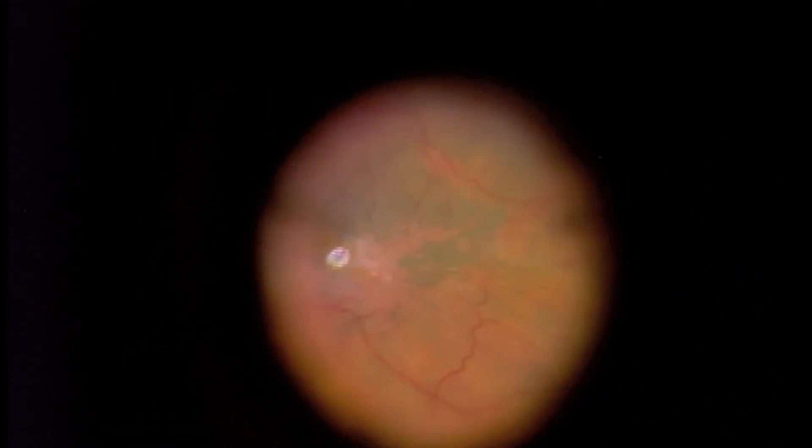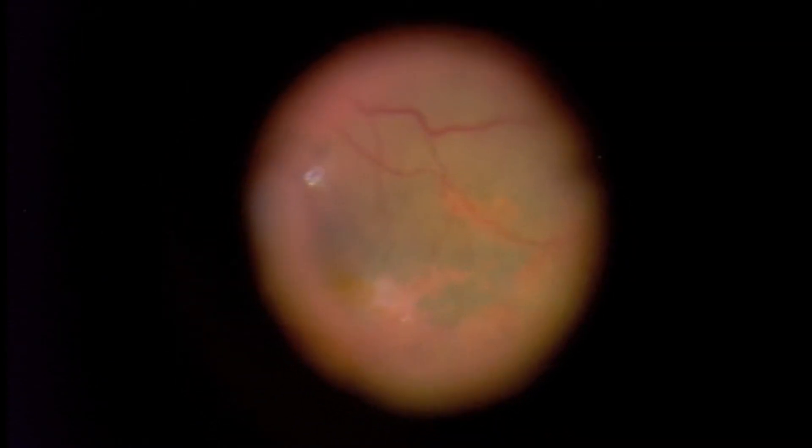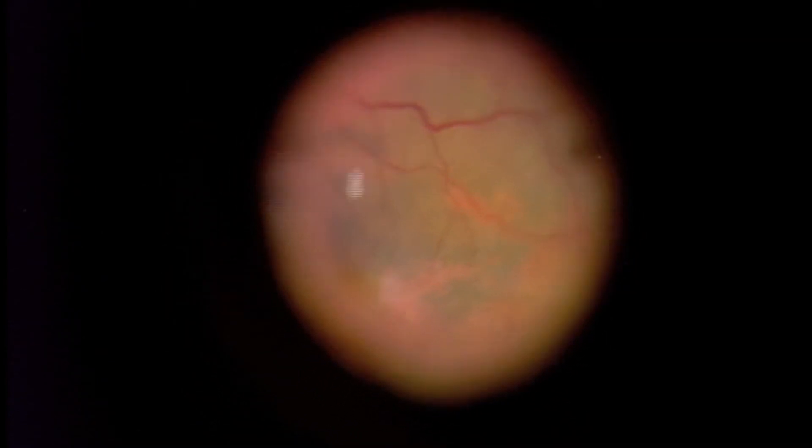And you're going to see a very faint green patchy material, there you go, that is actually lying on the surface of the retina. And this is the macular pucker or epiretinal membrane.